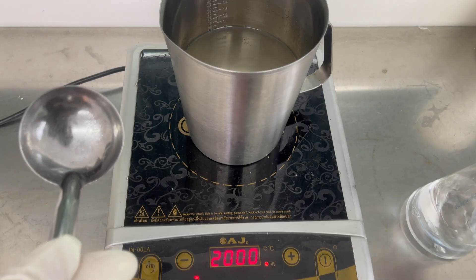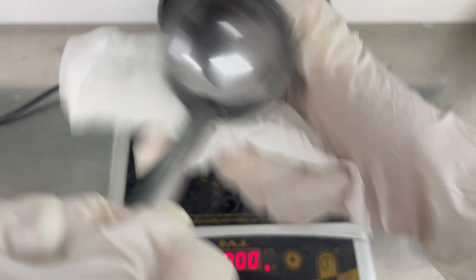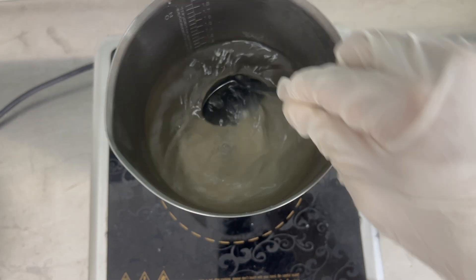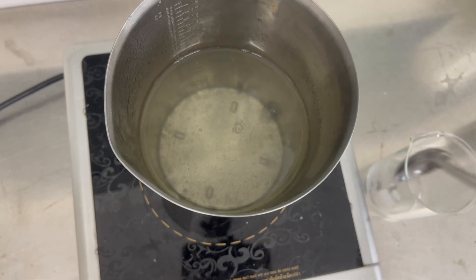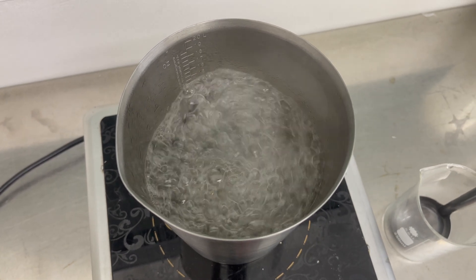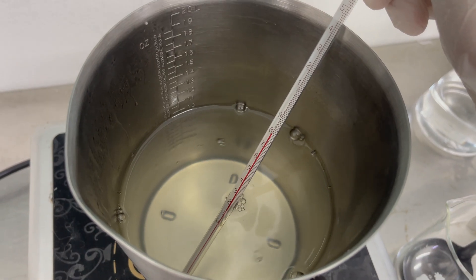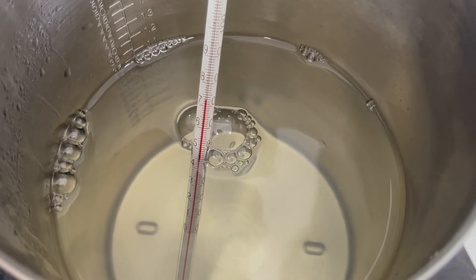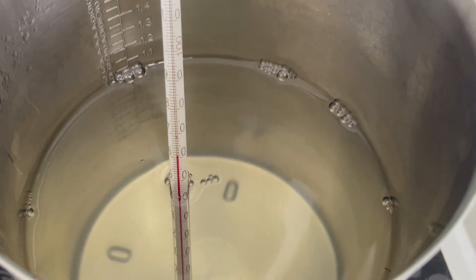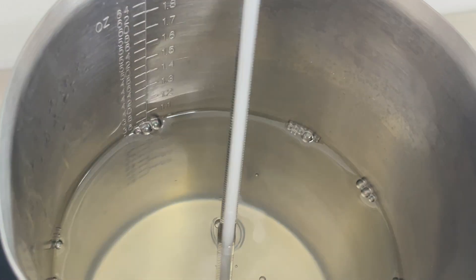Last step: heating and finalizing the media. I wipe my tools with 70% alcohol for sterilization, then bring the solution to a boil, stirring occasionally — this ensures the gelling agent fully dissolves. Next, turn the heat off. I monitor the temperature with the thermometer and wait for it to drop below 60°C before adding in the PPM. Adding PPM to hot media can degrade it and reduce its effectiveness, so add it when the temperature drops below 60°C — but don't leave it too long since the media will start to solidify.